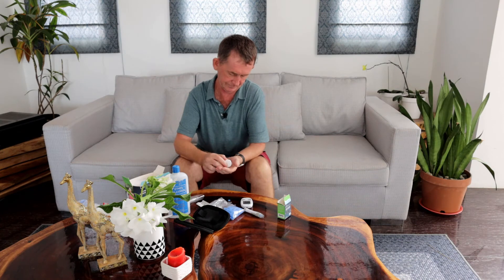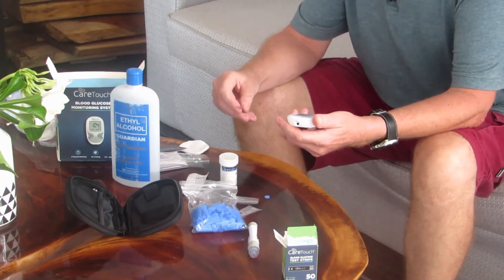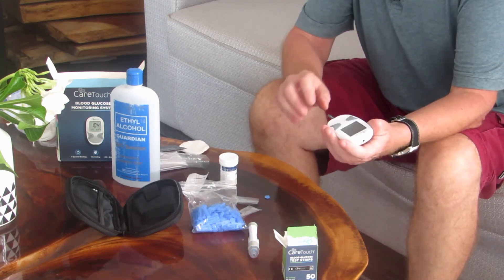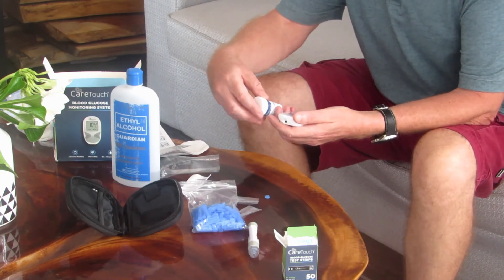Next we take out a test strip. When you open the test strip box, take one out. It says not to handle it on the end. There is an arrow on it telling you which way to insert it — there's an arrow here, so that means it goes in this way. We put the test strip in here and turn on the device. A blood drop icon starts blinking, telling you it's ready. It gives you the batch number on screen and it should match up with the strip box.